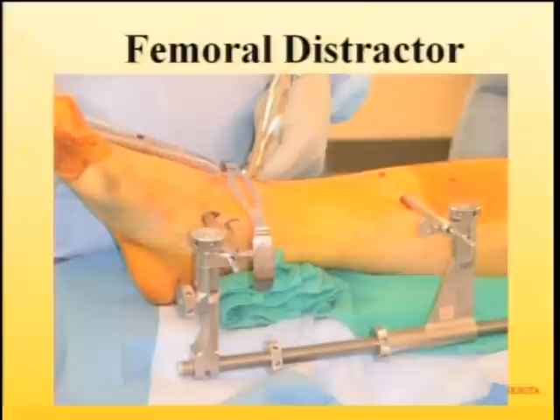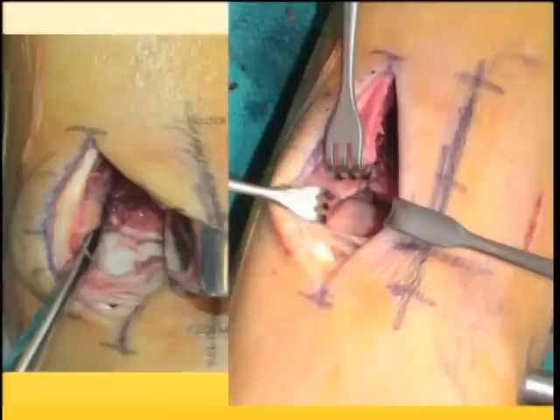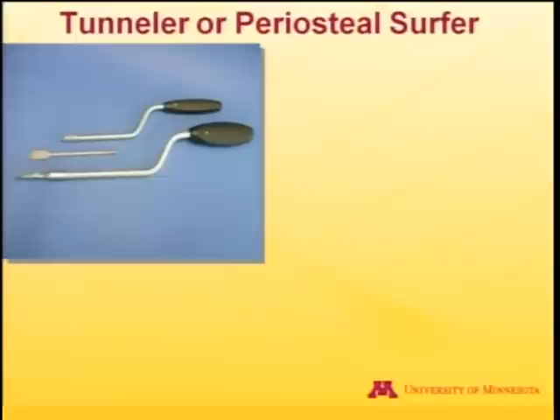But if you go to a fracture course with 60 or 70 residents in the room and you say, how many people here have used a femoral distractor? You may get three or four hands in that size of a group. I don't understand that. And this is the difference between when it is not applied and when it's applied. It opens up the landscape significantly.